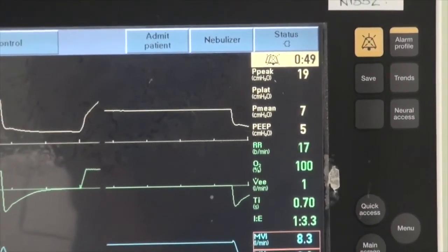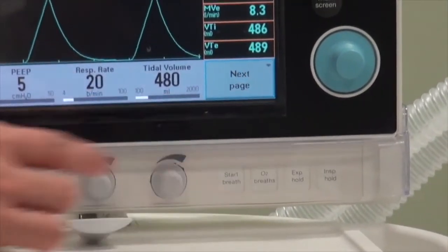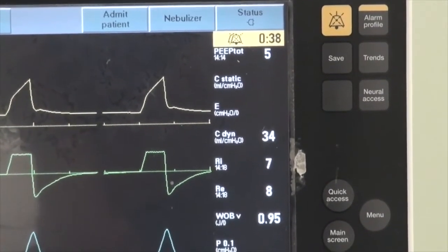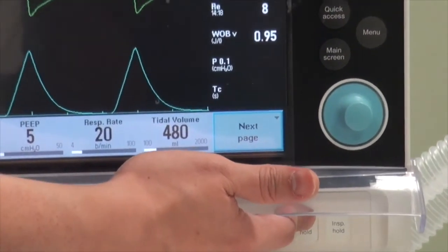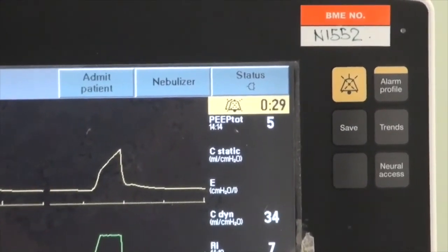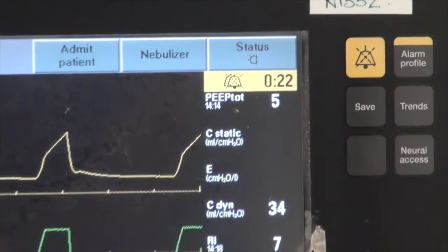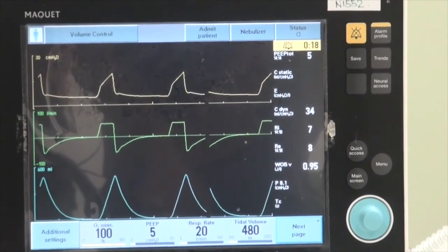For an expiratory hold to measure total PEEP, go to the screen that reflects total PEEP. The expiratory hold button is next to the inspiratory hold button. As you activate it, the pressure will equalize and you will see the total PEEP — in this case 5, which is similar to the set PEEP — indicating this patient does not have a significant auto-PEEP issue.